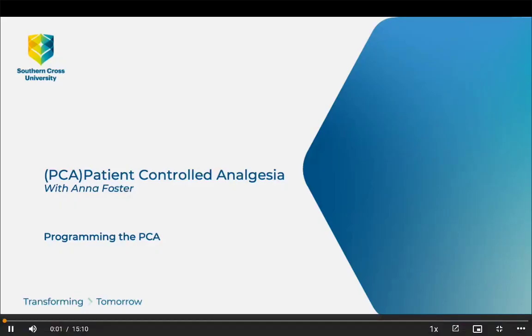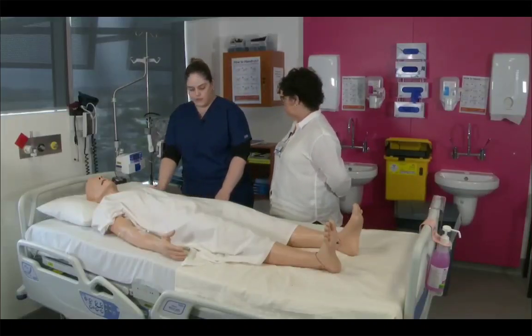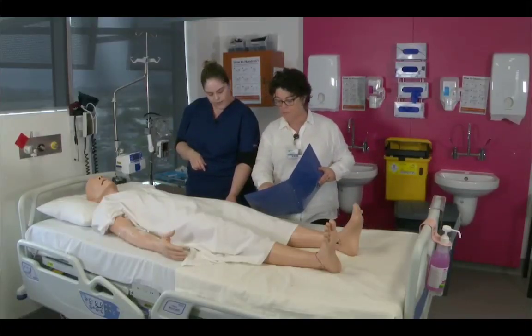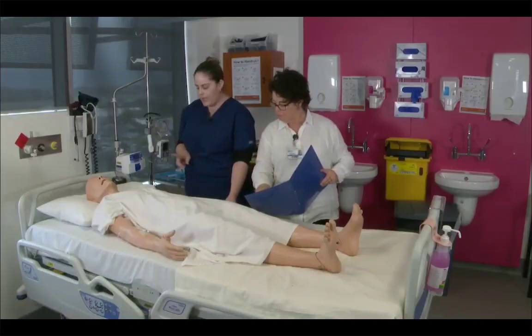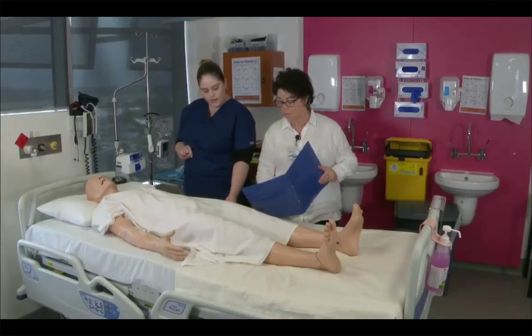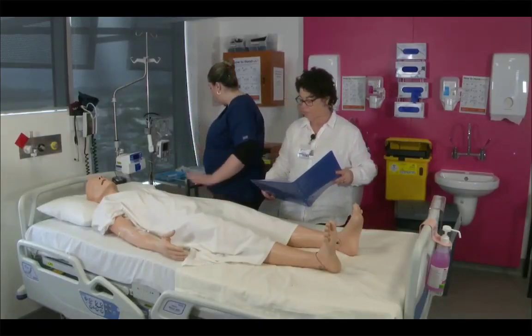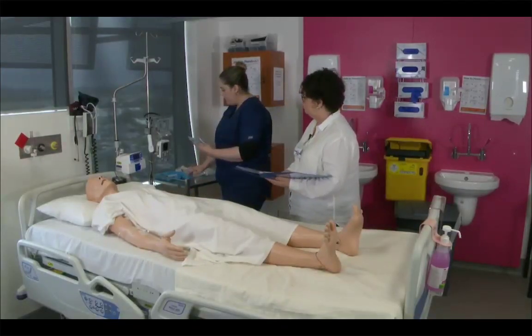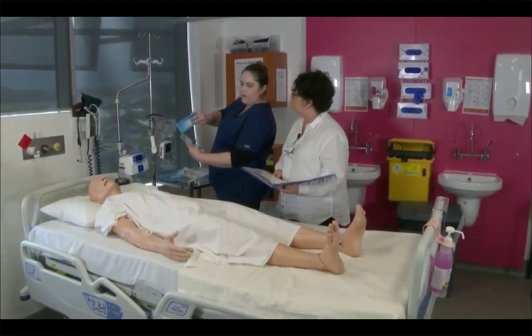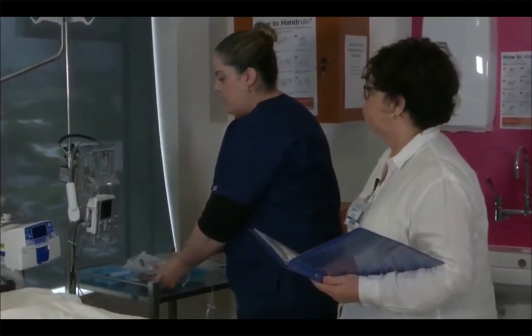Once you re-enter the bed space, remember to reintroduce yourself to the patient and remind them that you're there to complete a PCA setup. Again, you're not gaining consent at this time, you're still performing the setup. John Bryant, and his date of birth is the 13th of the 3rd, 1948. And do you know anything about allergies at all? No allergies, okay. And MRN is 201705. Correct. Okay, and so as we know, we have just made up our order for fentanyl, 1,000 micrograms. So that's 500 and 500 in 10 mils each, and we've put that into a bag of sodium chloride. Okay, yes. So we're ready to come to our PCA.